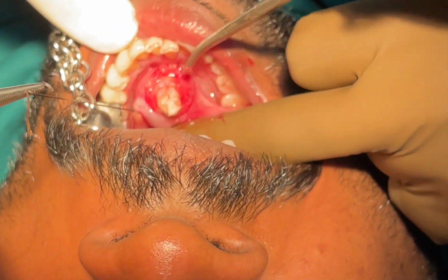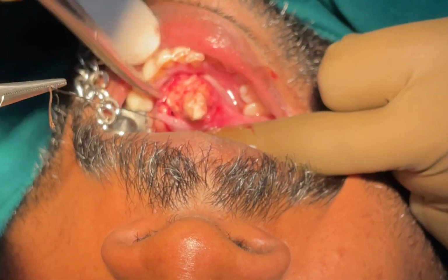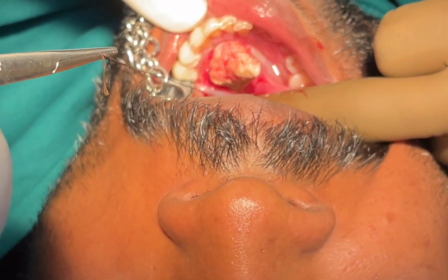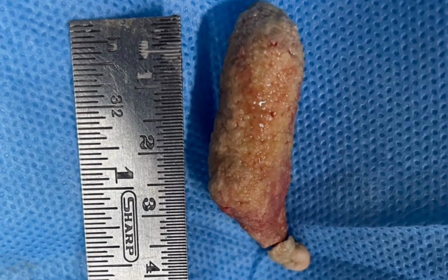So the stone is almost 4 centimeters in length, which was measured in the CT and excised. So you can see that's a 4 centimeter stone.